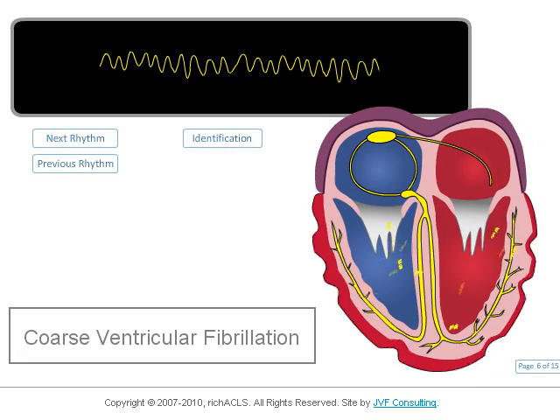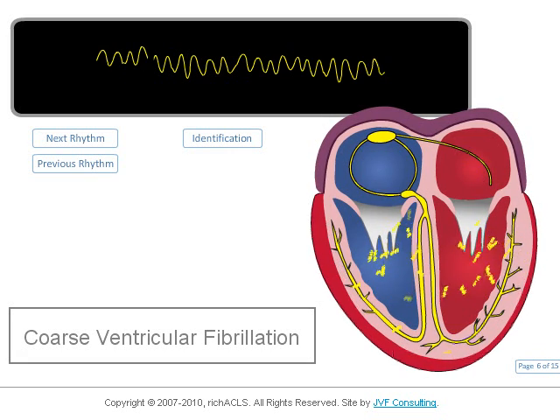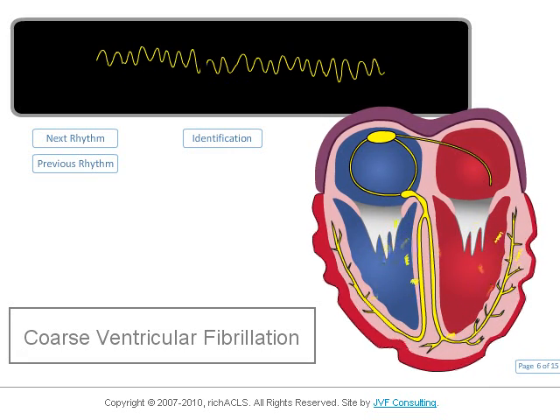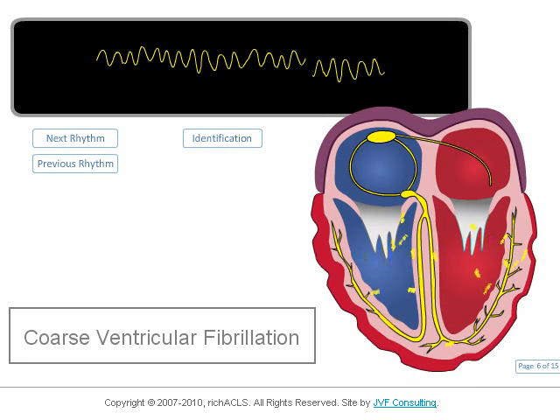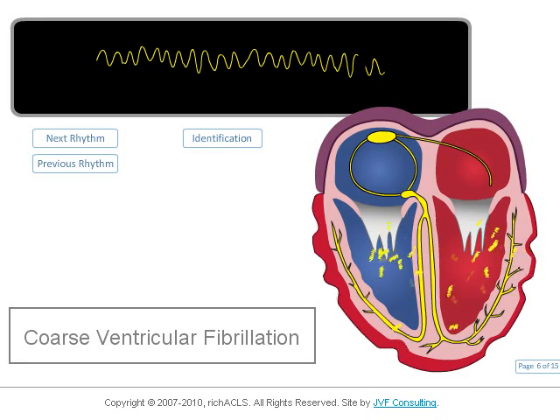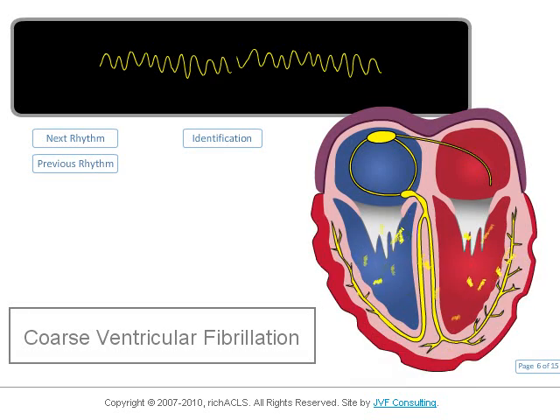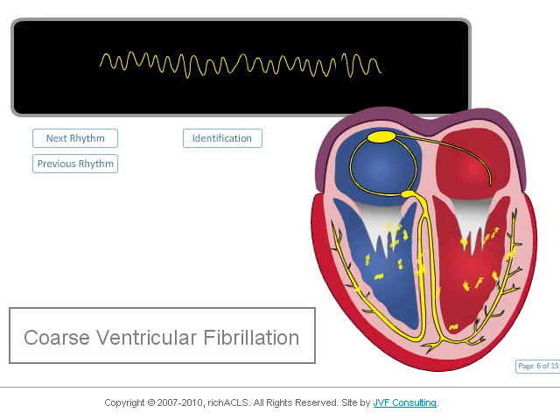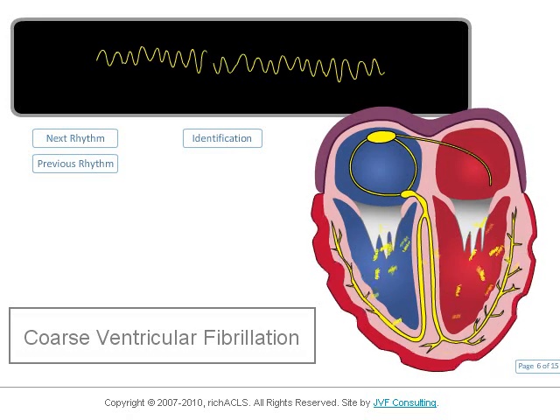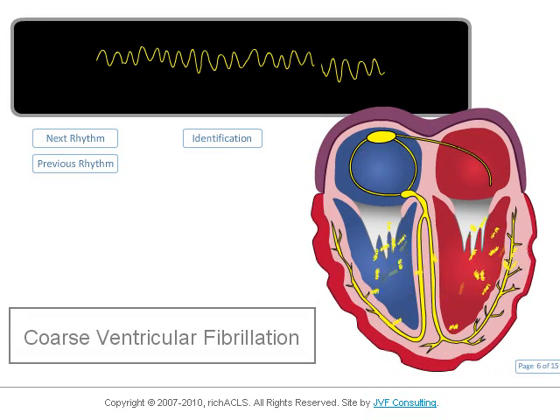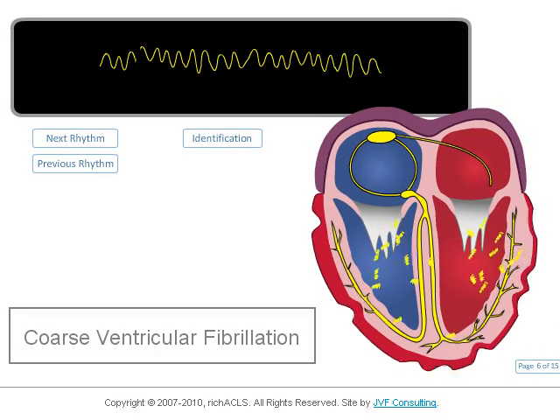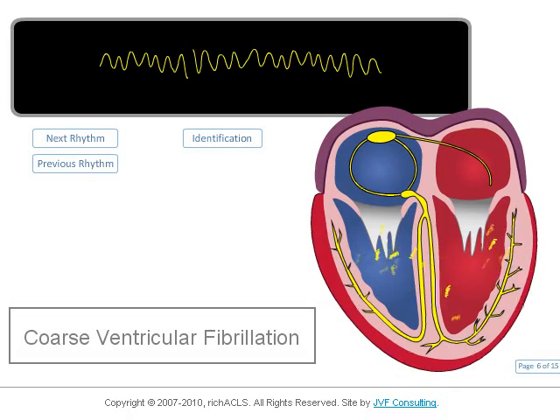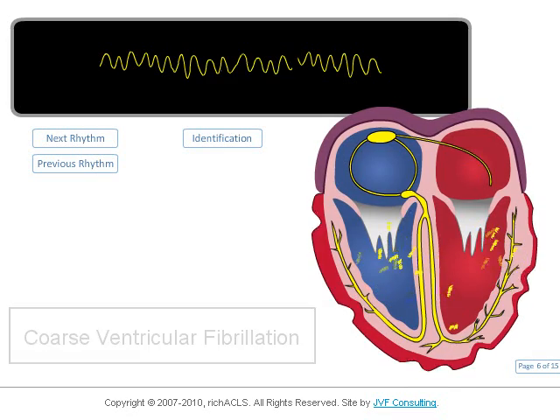This fibrillatory rhythm is not unlike atrial fibrillation, except with ventricular fibrillation, there is no cardiac output. Coarse ventricular fibrillation is of recent onset and has a fairly high probability of successful defibrillation, since the substrate for metabolism has not yet been depleted.